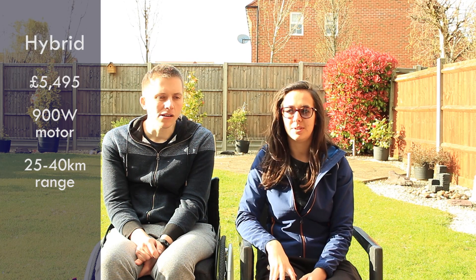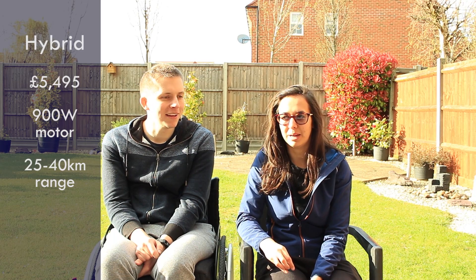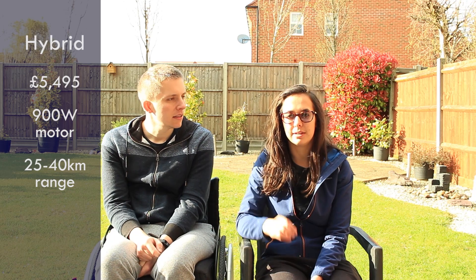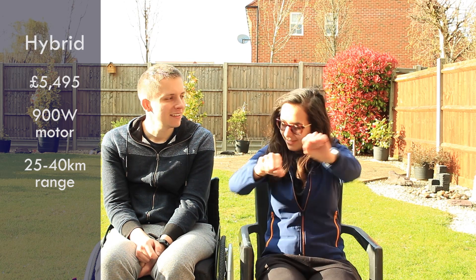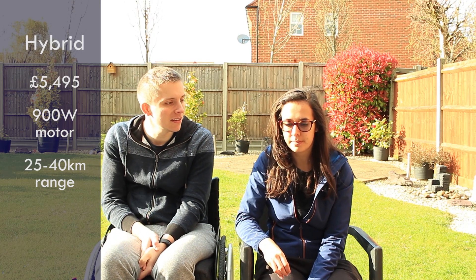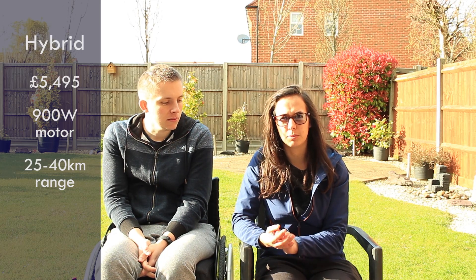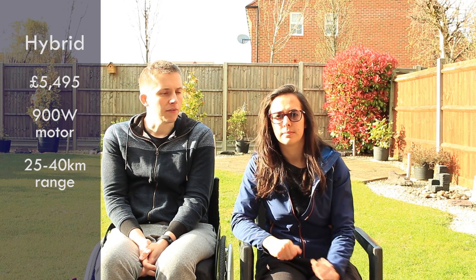The benefit of the hybrid is you've still got the manual option — you can manually cycle the handbike even if it's a bit heavy. Also, going downhill it actually recharges, or if you're just freely rolling. So if you find you're running out of power you could do a lot of rolling and see if that helps. They have different battery sizes which obviously give you more range, though only the small one is flight-approved due to limits on battery size for planes.